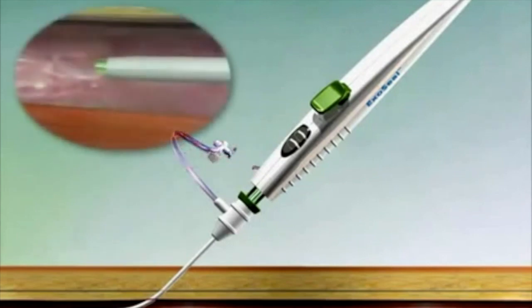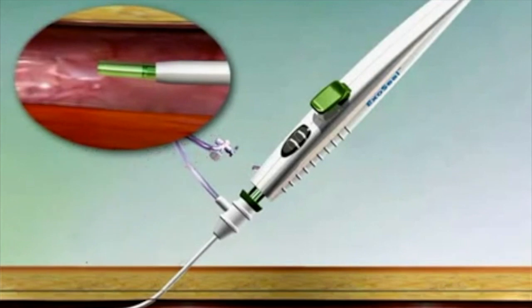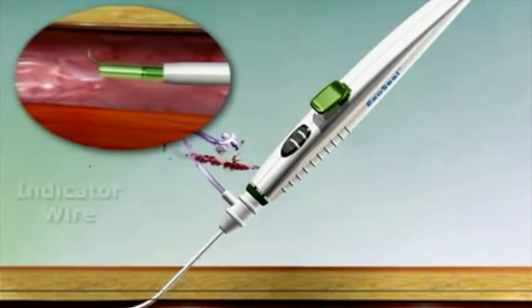The indicator wire will automatically deploy when the wire cowling locks into position against the device handle and a click is heard.